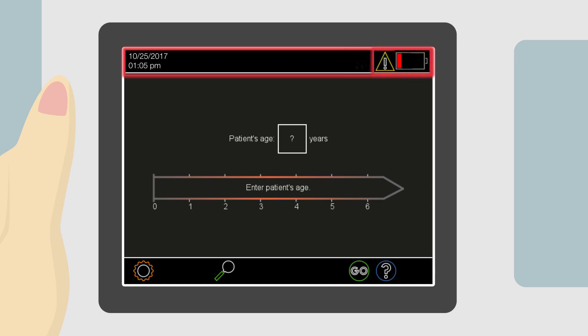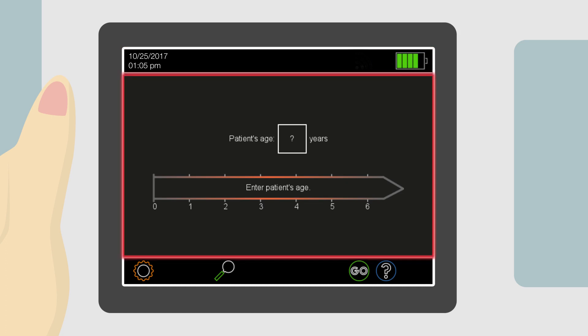A warning symbol will appear when the device detects low battery, alerting the user to connect the device to the power supply. The device remains operational while charging.